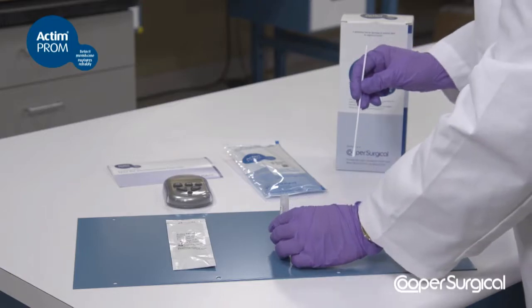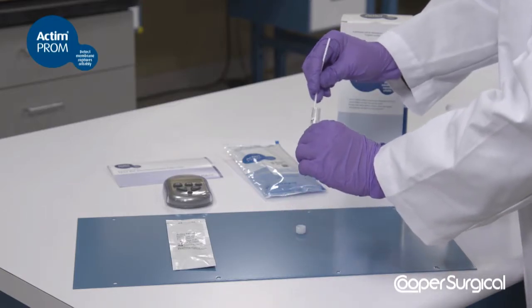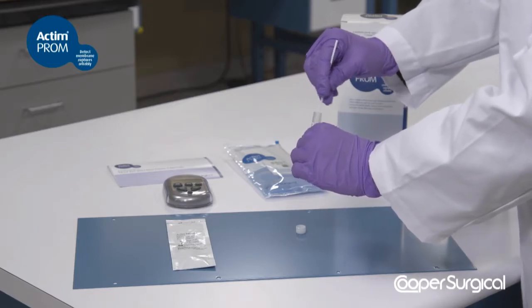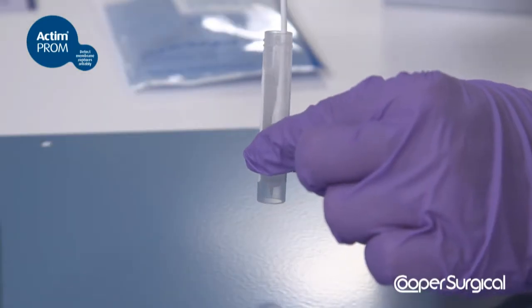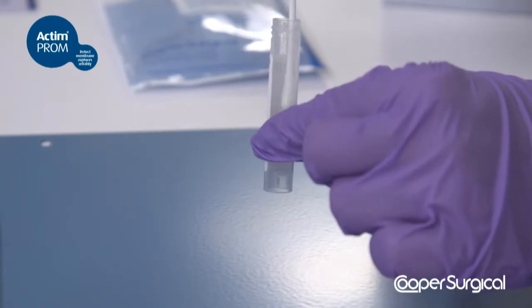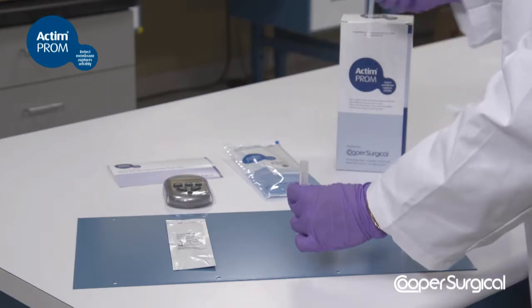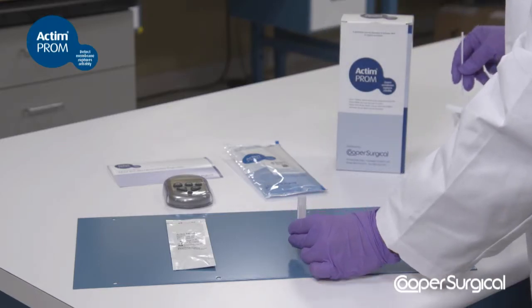Immediately extract the sample from the swab by swirling it vigorously in the specimen extraction solution for 10 to 15 seconds. Press the swab against the walls of the tube to remove any remaining liquid from the swab. Discard the swab — the specimen is now ready for testing.